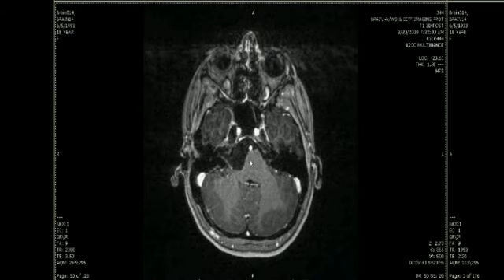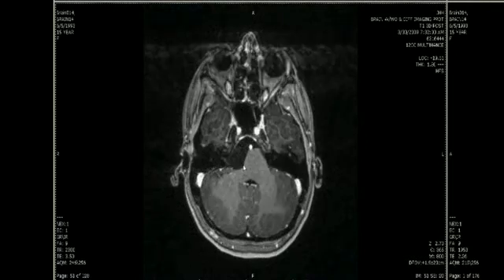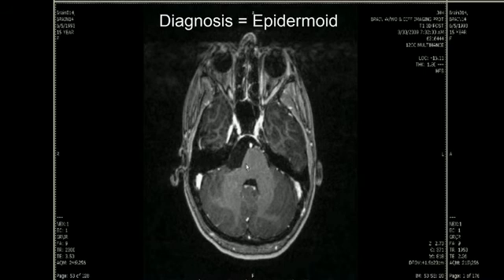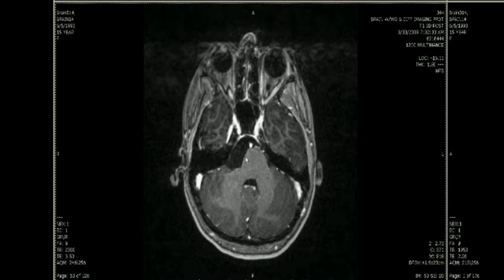So the combination of features of a cystic lesion which does not show contrast enhancement, but which has high signal intensity and restricted diffusion on the diffusion-weighted imaging in the cerebellopontine angle cistern, is highly suggestive of epidermoid as the most likely diagnosis.